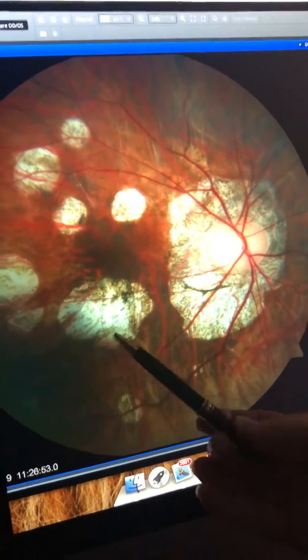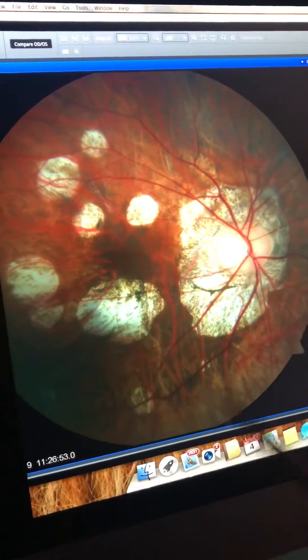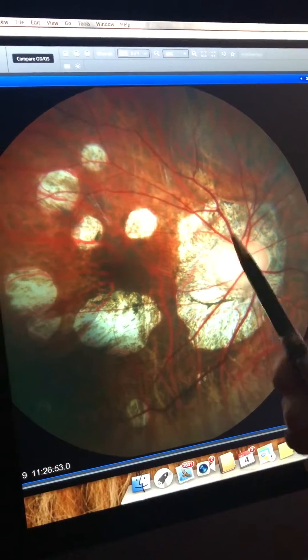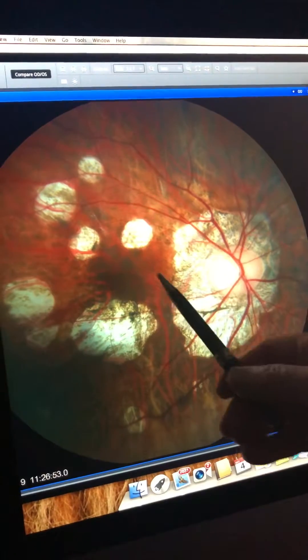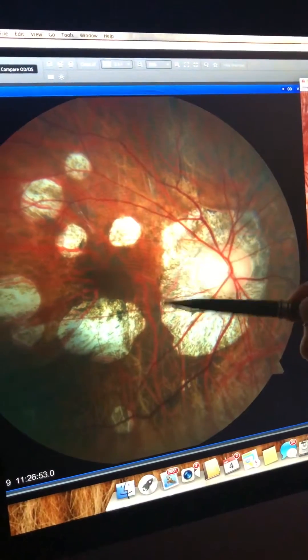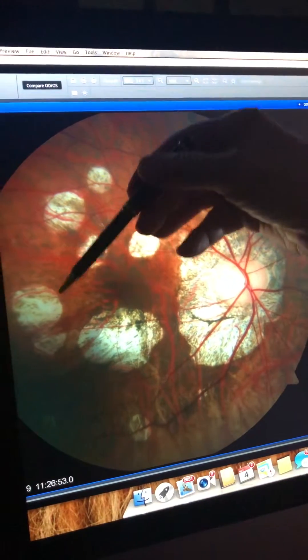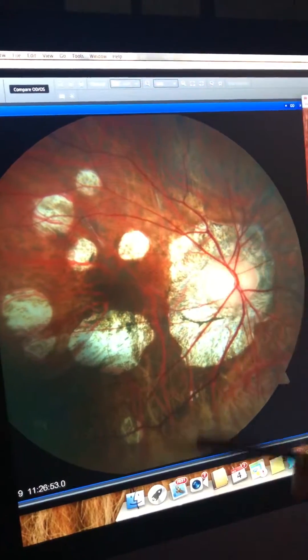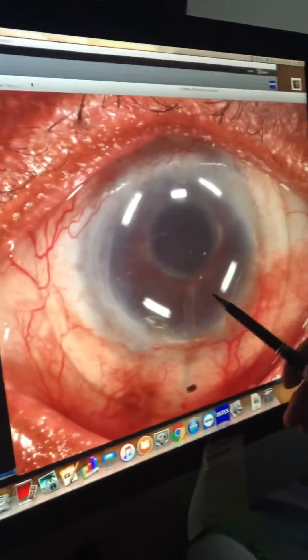We're fitting this patient with a special contact lens to give her some vision. This is her good eye, by the way, and with this special scleral lens she'll be able to see approximately 20/40 vision with this eye.